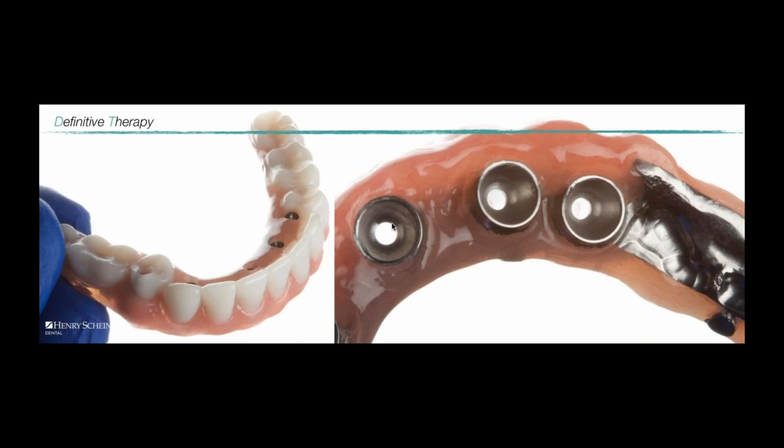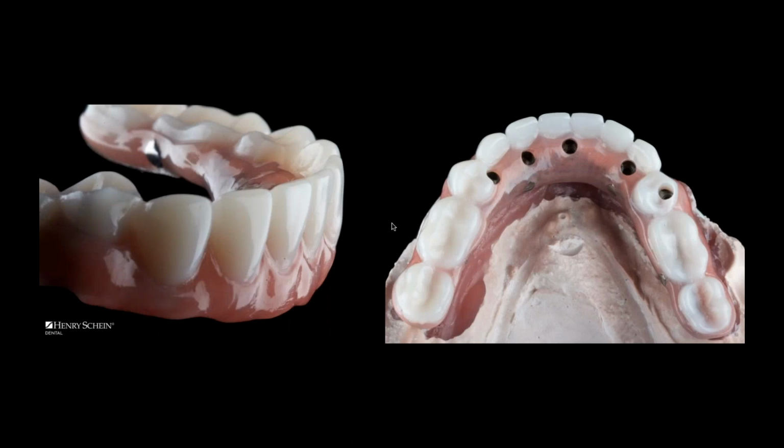and go from final impression to delivery, or what I consider today data acquisition, which is scan the patient, scan the prosthesis, scan, articulate, get all that information in the digital world. So we do data acquisition to delivery in 2 visits. And that is why today full arch implant restorations have become the easiest restorations I do, because when it comes to definitive therapy, I can go from data acquisition or final impression to delivery in 2 visits.